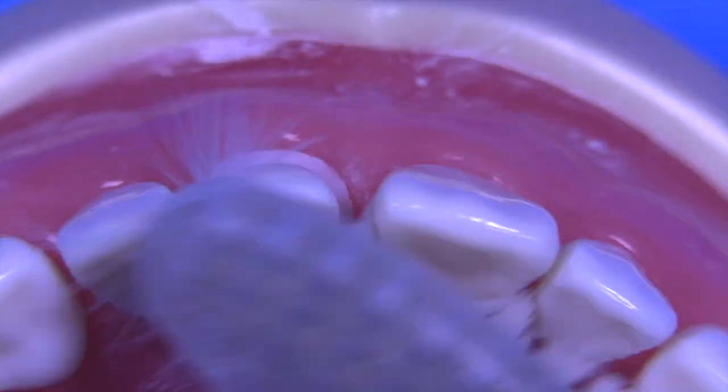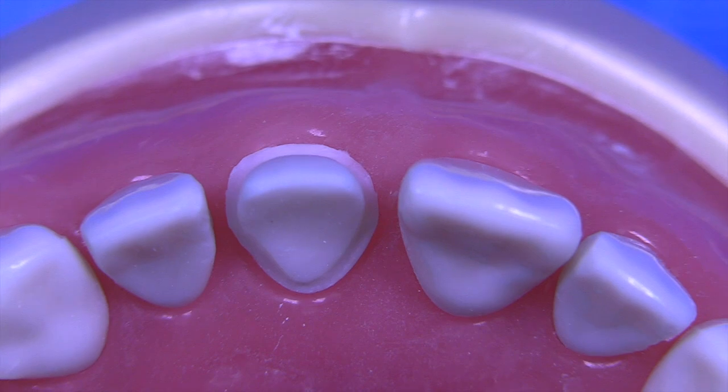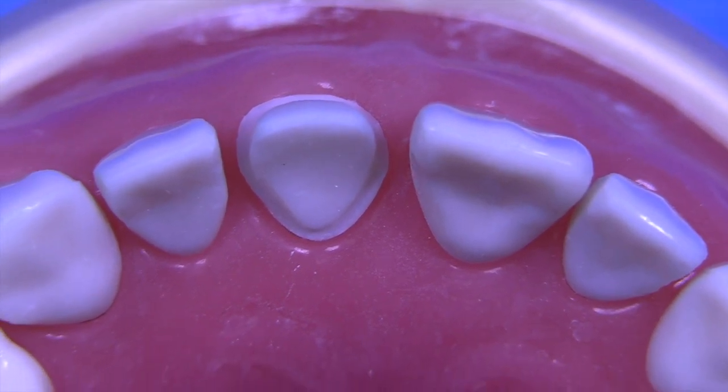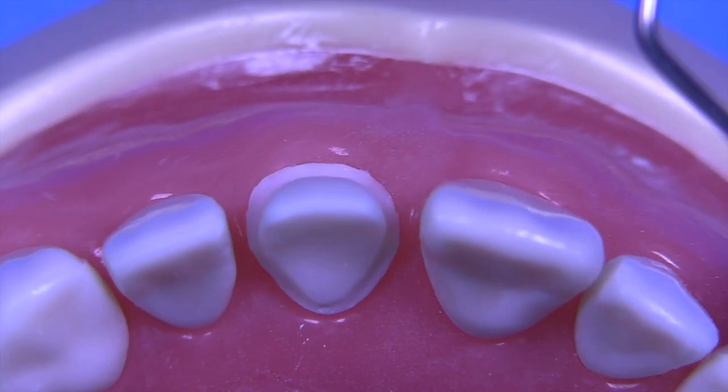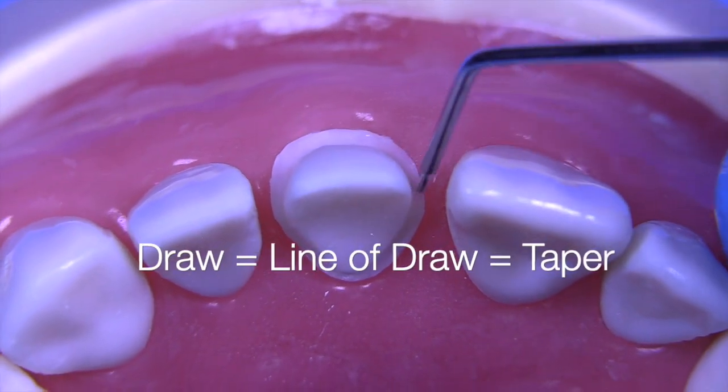I usually use a brush like this, either dry or with a little bit of a product that we have called Secret Sauce that cleans things up really nicely, and then it looks a lot better. Does it draw? The question is, does it draw all the way around?